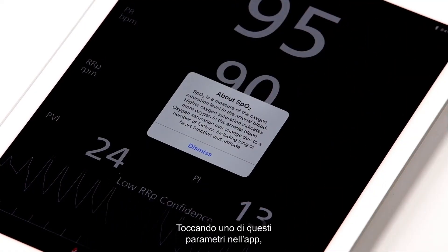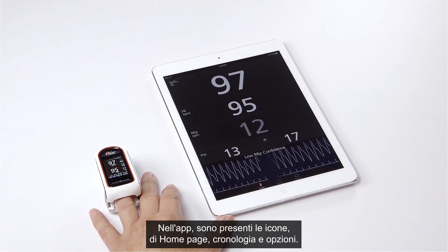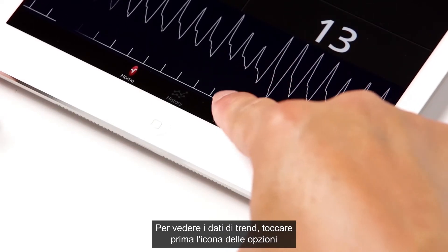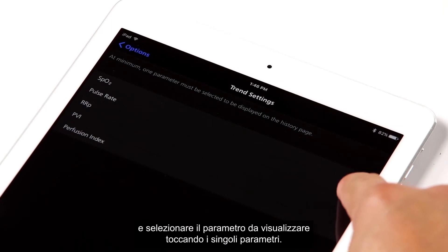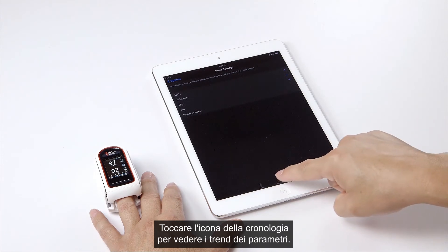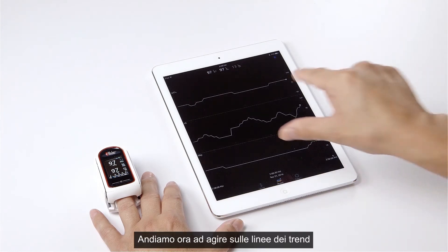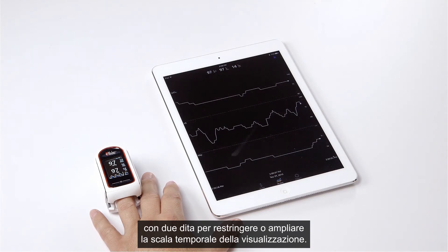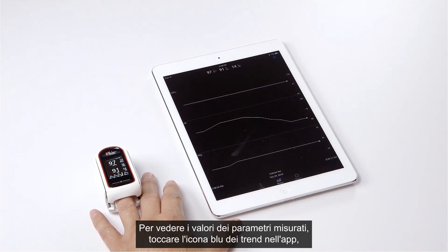Tap on any one of the parameters on the app to see a detailed explanation. On the app, you will see the home page, history, and options icons. To see trended data, tap on the options icon first, then tap the trend settings icon and select the parameters you wish to view. Tap on the history icon to see your parameters trended. The MightySat RX will record up to 12 hours of parameter data. Toggle on trend lines and use two fingers to shrink or expand the timescale. Tap on the blue trend icon to see the measured parameter values.